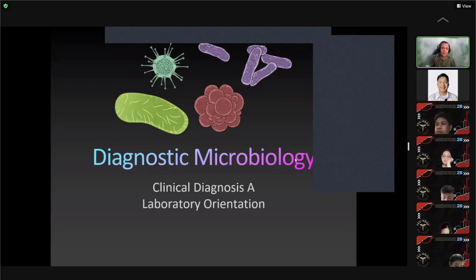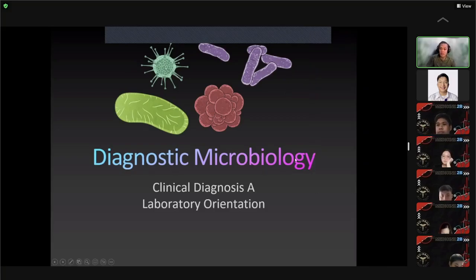Okay, so microbiology is a section of the clinical laboratory. And in microbiology, we study the bacteria, no? But it's also where fungi are cultured, and other tests pertaining to these organisms. Kasi when you say parasites such as your protozoals, they are in clinical microscopy. Okay.